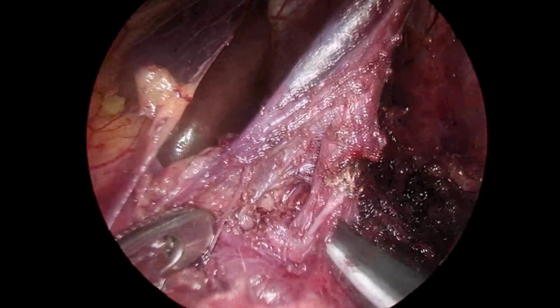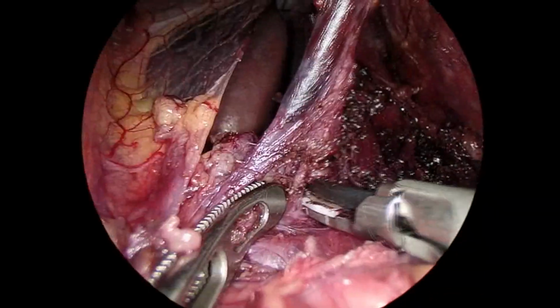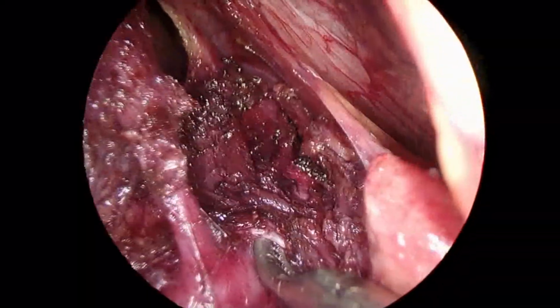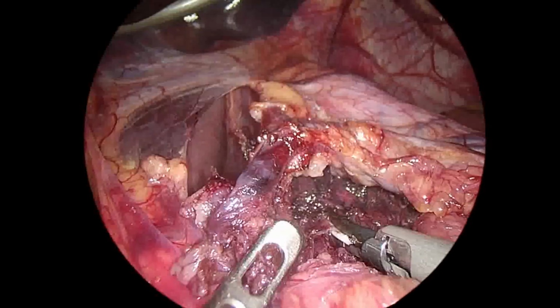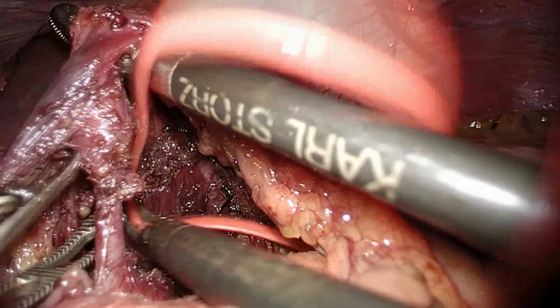So now here is the left gastric again being dissected, and all the tissues around the vessels are being made bare. And this is a tough structure which is dissected with the Maryland, and now with the ultrasonic scissors, and we are cutting the tight ligament. Once this is released, you will see the vessels pulsating in a very nice manner.